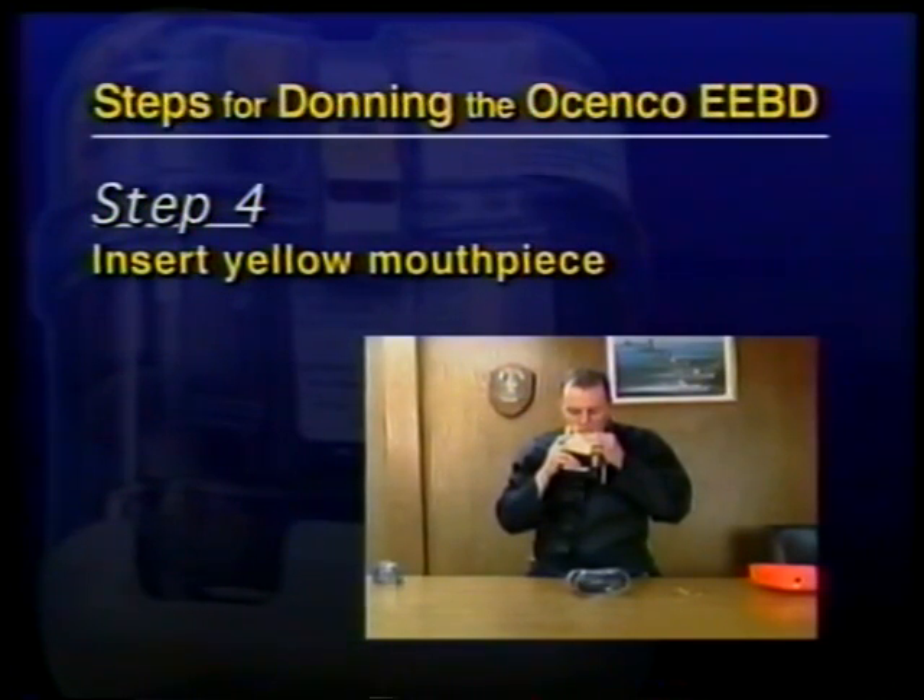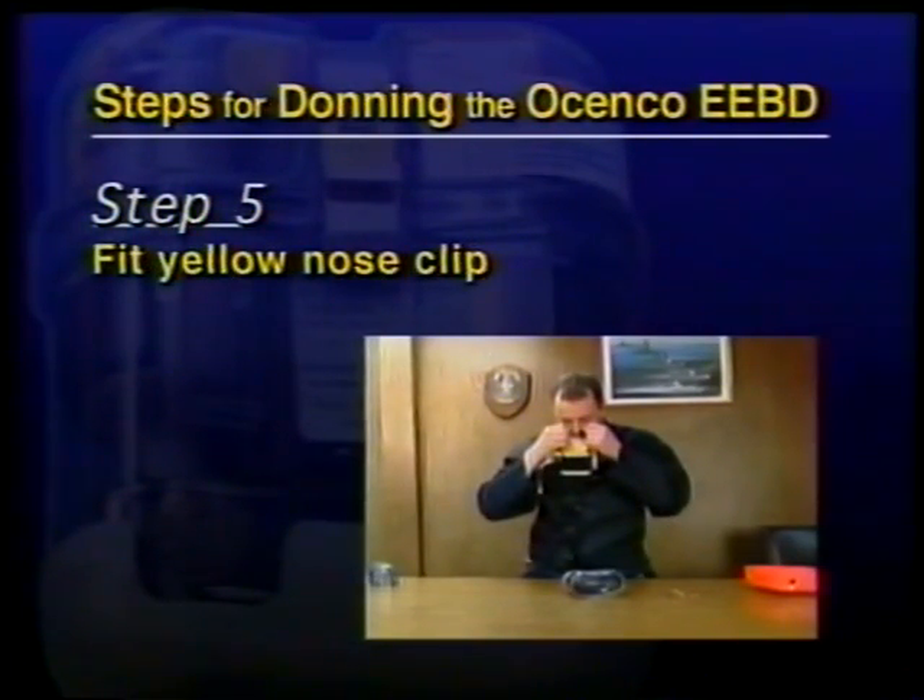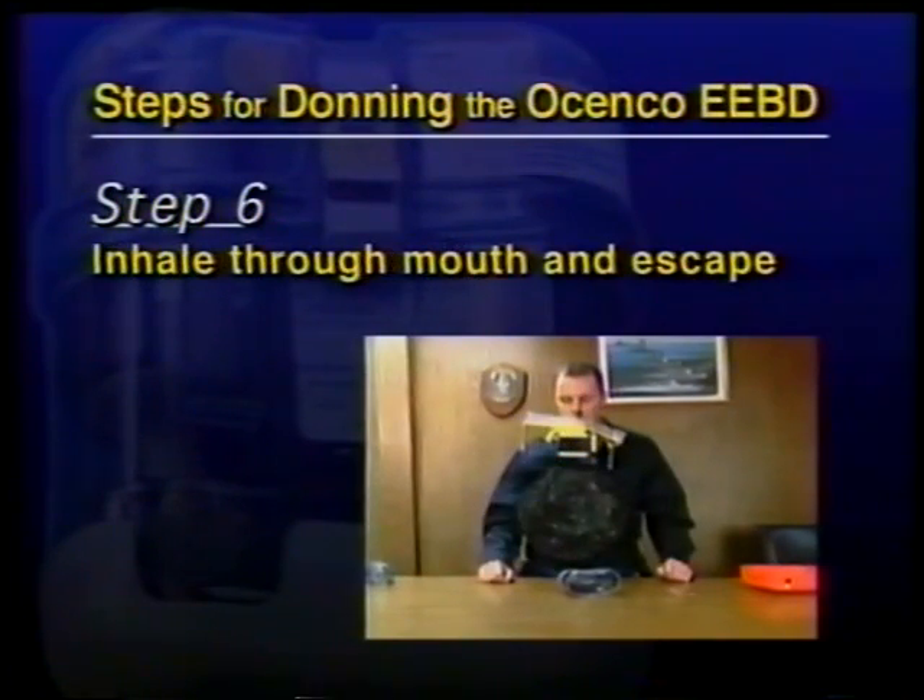Step 4, insert the yellow mouthpiece. Step 5, fit the yellow nose clip. Step 6, inhale through the mouth and escape.